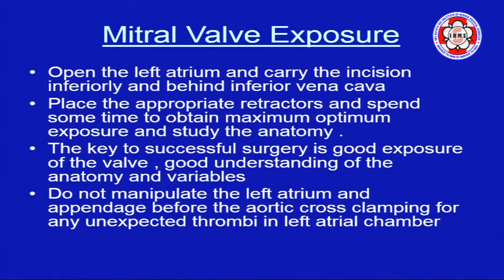Open the left atrium and carry the incision inferiorly and behind the inferior vena cava. That's always a very good way to have adequate exposure just by this simple maneuver. Other thing is place retractors. Spend some time to obtain maximum optimum exposure and study the anatomy.